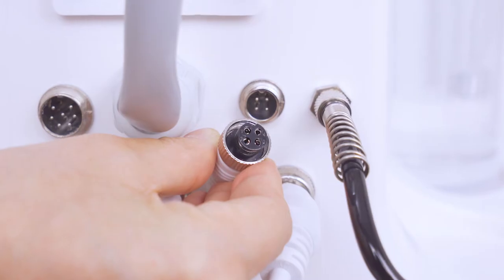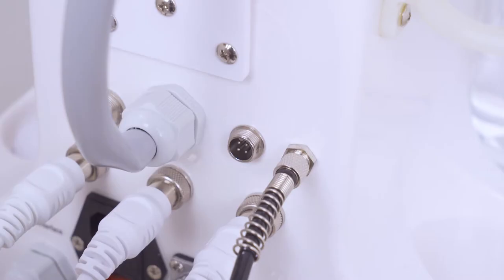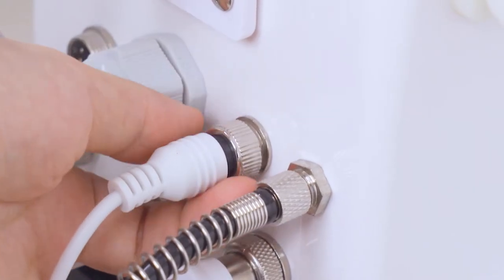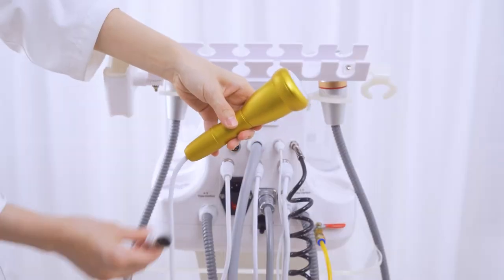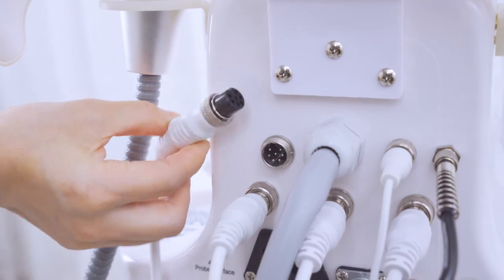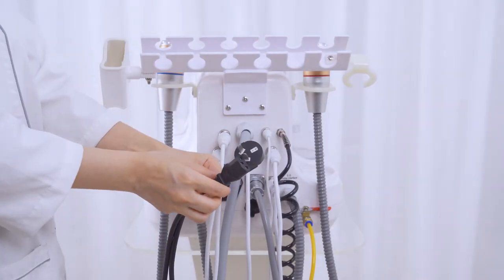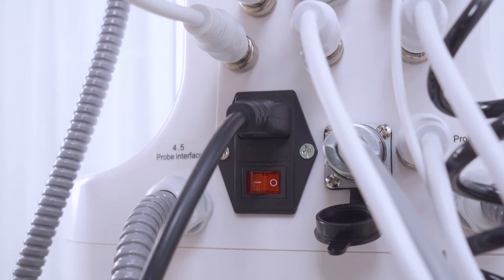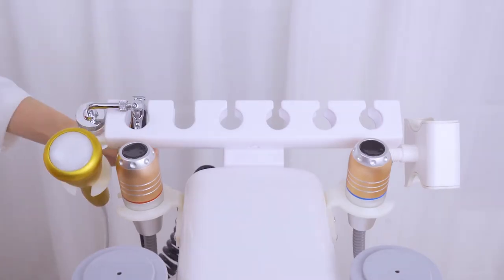Connect the 7-color light mask handle with the device and tighten the screw. Connect the vibration massager handle with the device and tighten the screw. Place all handles onto the handle holder.